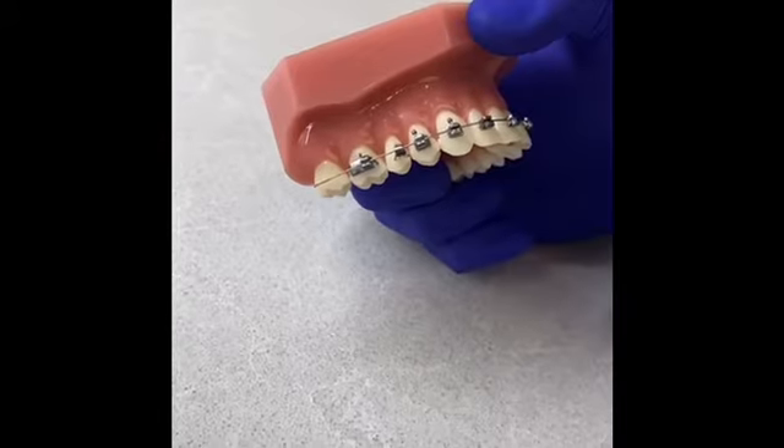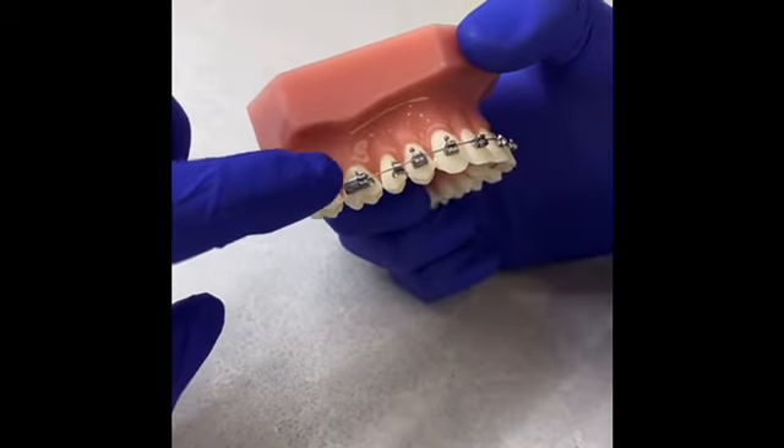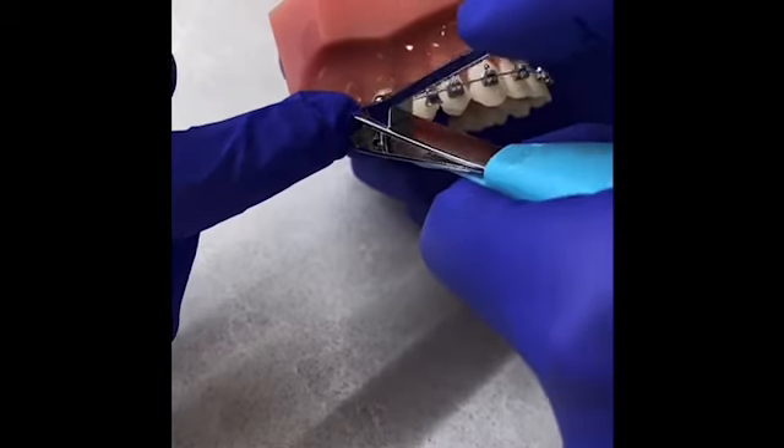If the last bracket has come loose, you'll notice that there's a significant amount of wire that could be bothering your cheek. Reach back, hold the wire against your tooth, and have someone else take a clean pair of nail clippers and trim the wire.